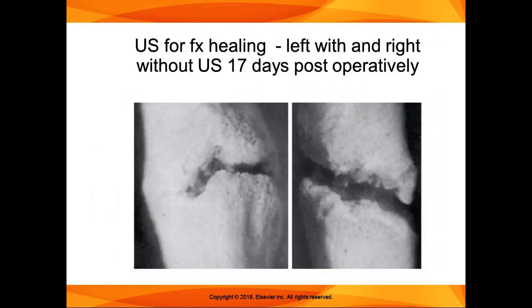And this is a study that is stated in the book where ultrasound was used for fracture healing. So the left side used ultrasound and the right side did not use ultrasound, and you can see that there is more bone healing on the left side where they used ultrasound. So you can look at the details of the study in the book. And this was an animal study, so animal studies aren't always clinically relevant because, of course, animals are going to be different, but a lot of times they are a starting place, and then the human studies can go on from there.